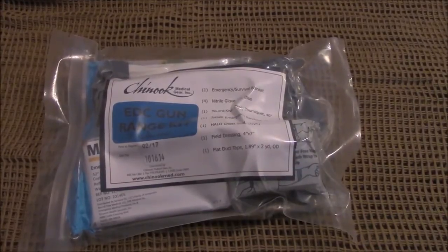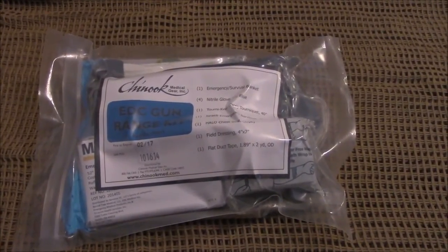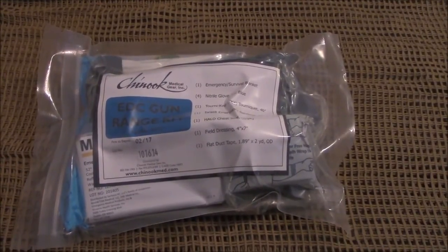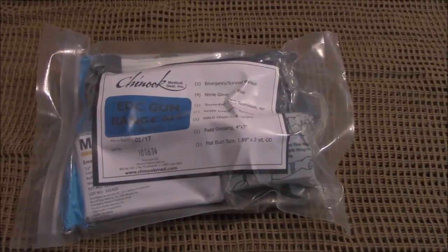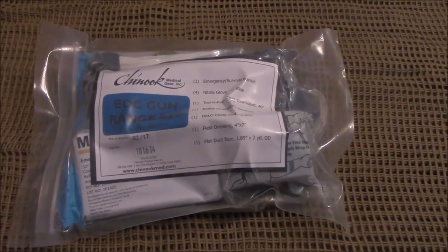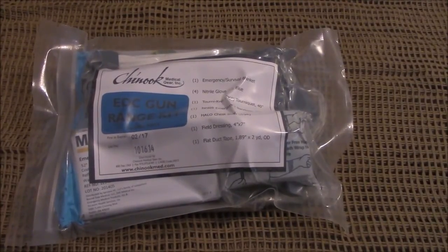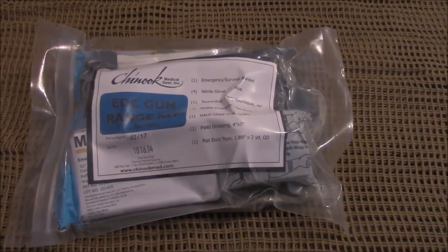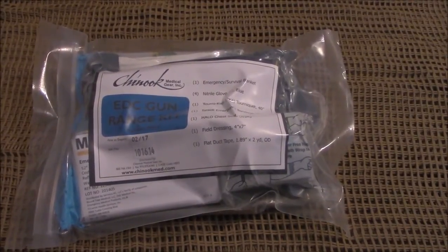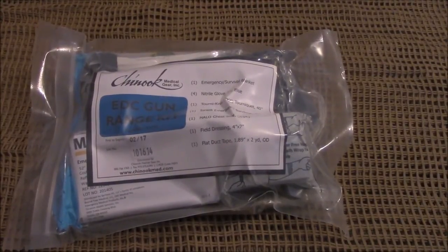Hey guys, I wanted to do a quick video on the EDC slash gun range trauma kit. This is the kit that students receive when they come through the basic emergency medical course. And again, this is not a first aid kit. First aid kits are typically something you want to use for a little boo-boo or a cut and throw a band-aid on. This is a trauma kit. So let's dive in and see what's included.